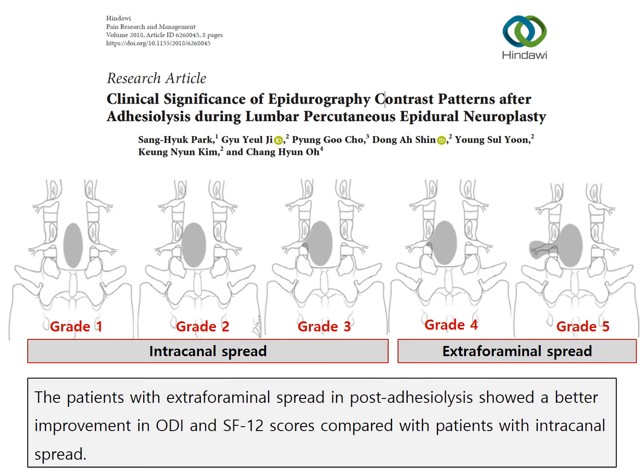And this paper shows the correlation of the contrast spreading pattern with the functional improvement. The patient with extraforaminal spread in post-adhesiolysis showed a better improvement in ODI and SF12 scores compared with patients with intracanal spread.